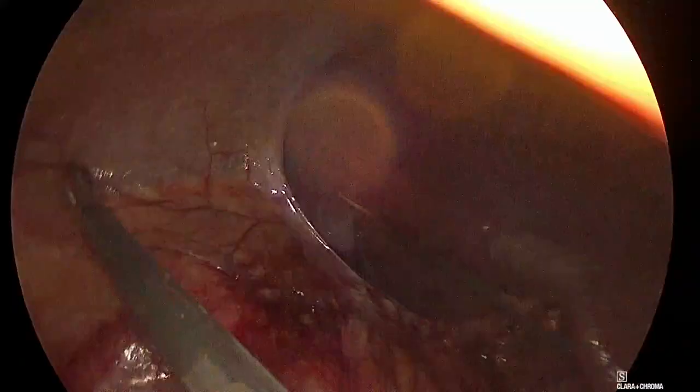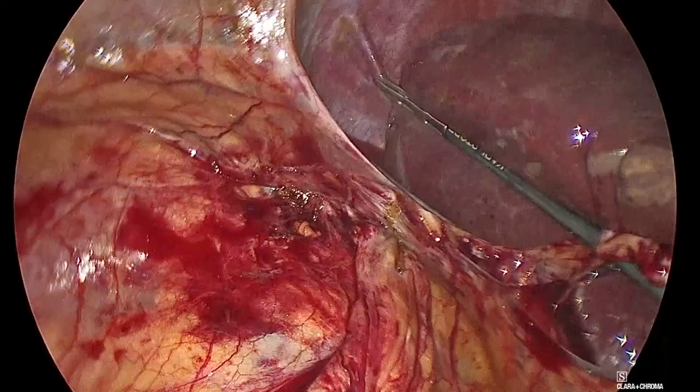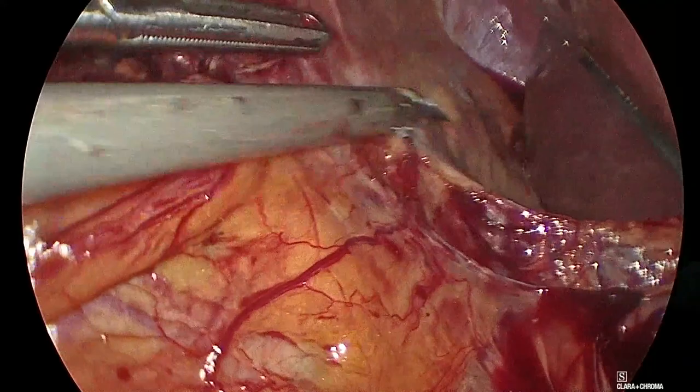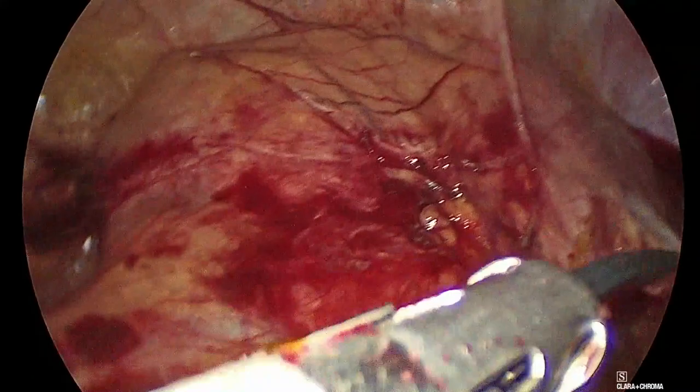Okay, so we go all the way up to where we marked it, and we just anchor a little bit of, okay, vamos arriba. Okay. So now you see that showed. Enséñale. Now you see that we have all the kidney exposed. The upper pole is here, so the liver is well lifted.